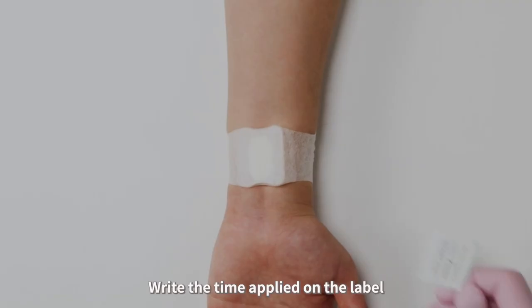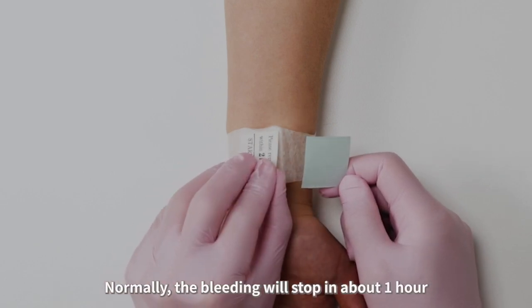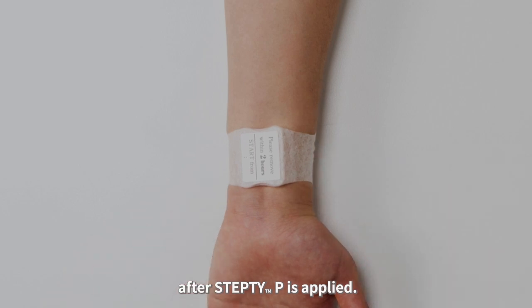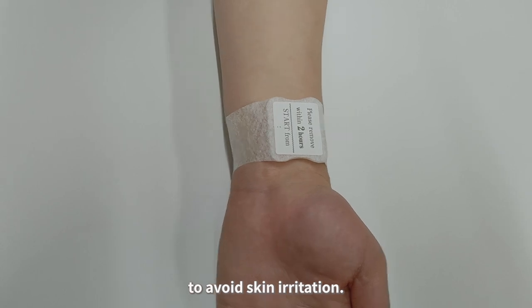Write the time applied on the label and then stick it on top of the pad. Normally, the bleeding will stop in about 1 hour after Step TP is applied. Remove it within 2 hours following application to avoid skin irritation.